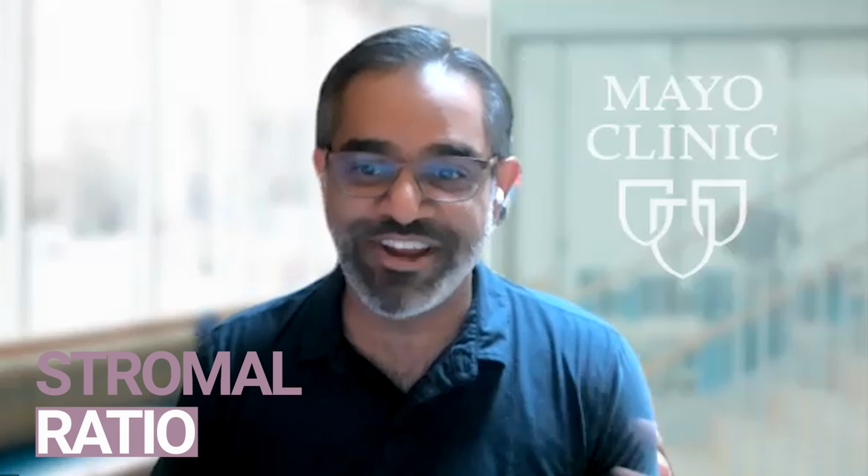Like, we know immune cells are important. We know tumor buds are important. We know the stroma ratio is important. Can we just extract those features in a quantitative way using image analysis? And does it correlate with outcomes, prognosis, recurrence, things like that? So it was actually a really simple hypothesis. Let's just do what we already do, but in a quantitative way and much less tedious.